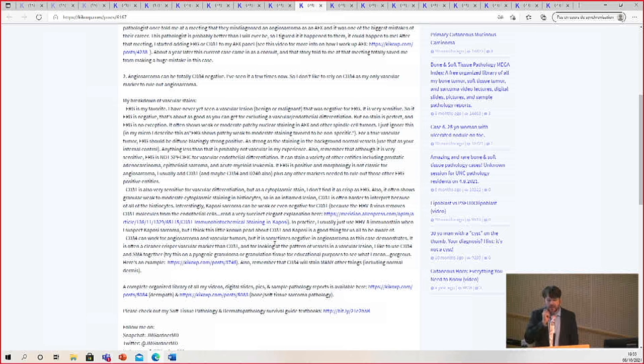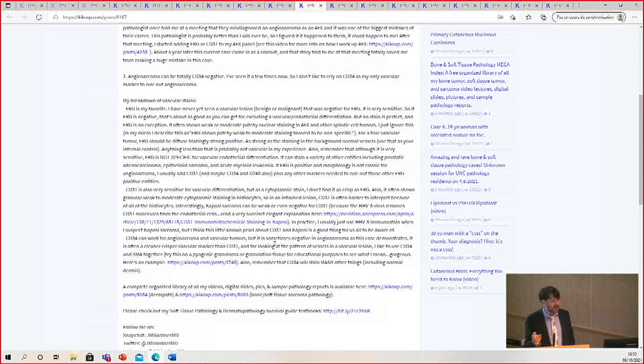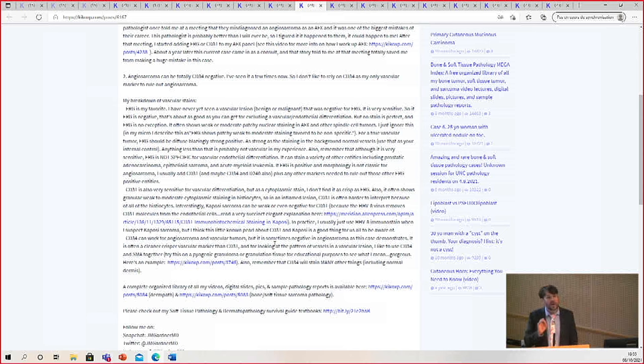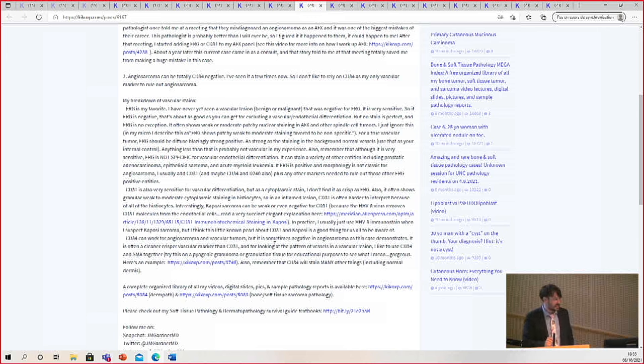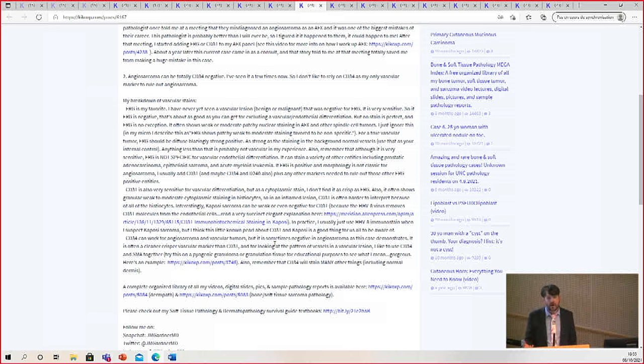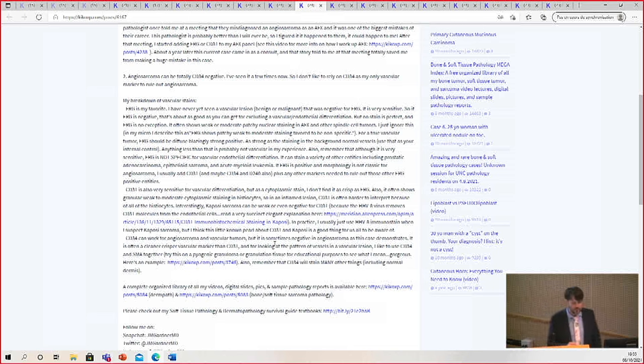And CD34 can sometimes be a nice stain for vascular tumors, but recognize that it can be negative. So in difficult cases, sometimes I'll use all three of those markers, but I recommend not using CD34 as your only screening marker for vascular tumors. It's dangerous because I've seen cases like this. Angiosarcoma is an aggressive tumor, sometimes treated in unique ways, different from other tumors and types of sarcomas. It has some unique things about it that need to make sure it's not missed.